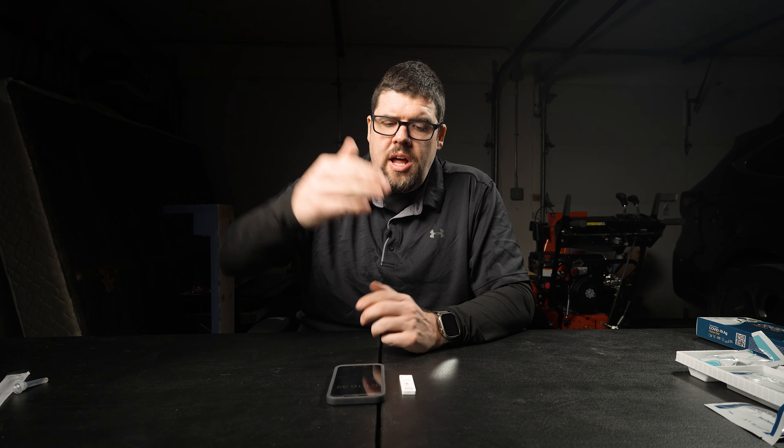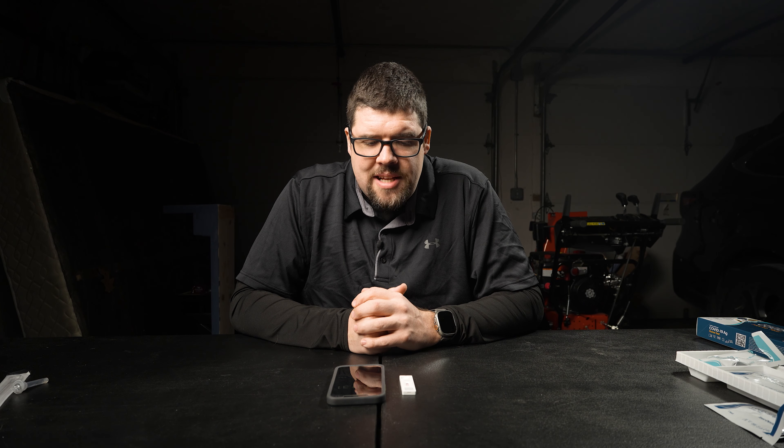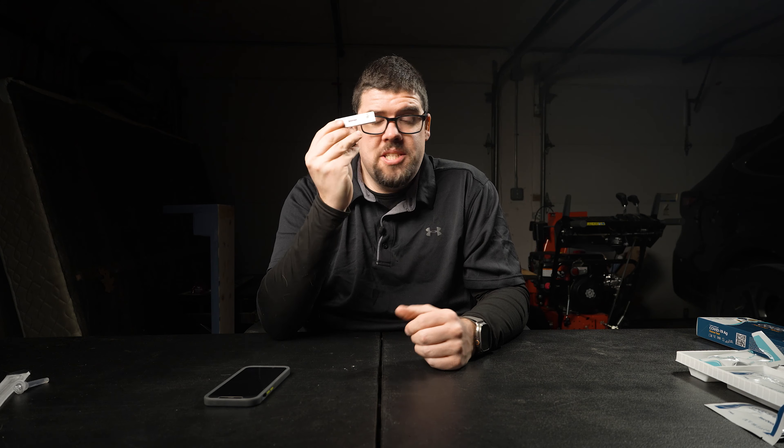On the box it says it's going to take 15 minutes to get test results. I'm not even in one minute yet and I can see that I have a T — so this is an awesome test because I'm getting really fast results. Now I'm waiting for the control to show a line. You want the C to also have a line because that is telling you you do not have a faulty test. Liquid's slowly moving up. We're at one minute and 20 seconds, passing by the C now. I see a faint line on the C — so this is a solid test. It worked. We are one minute 40 seconds. That was a fast test.